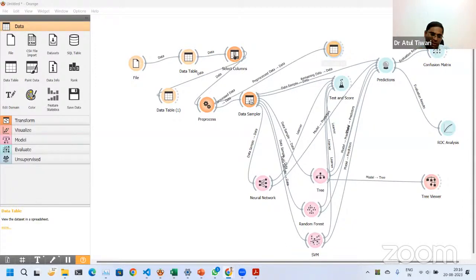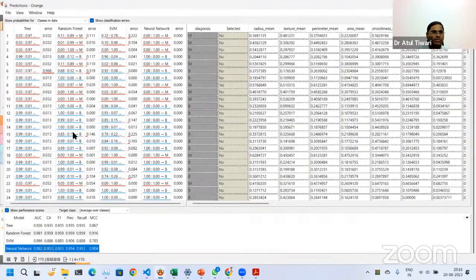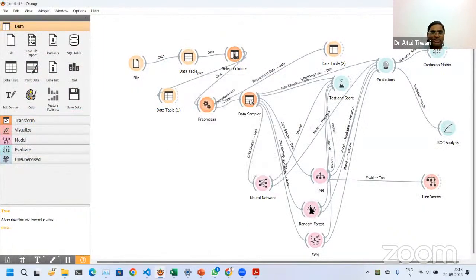If I go into actual AI, the big companies are using 3 types of data set. First one is training, second one is for validation, third one is for test. Training would be to create our model. Validation would be testing our model during the creation time. For example, here I showed you that in case of validation, my model performed with 95.9% accuracy. Now I will tweak some settings from my tree, from random forest, and again I will see my prediction. That would be my validation. Ultimately comes the test part. The test part in an ideal scenario would be on our final product. But if we are in the beginning phase, generally we use train and test data. We don't use the validation part.